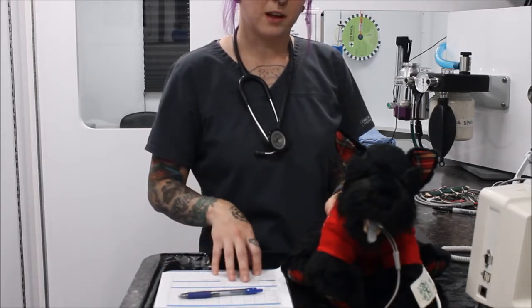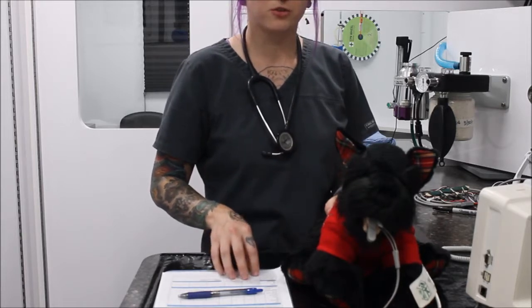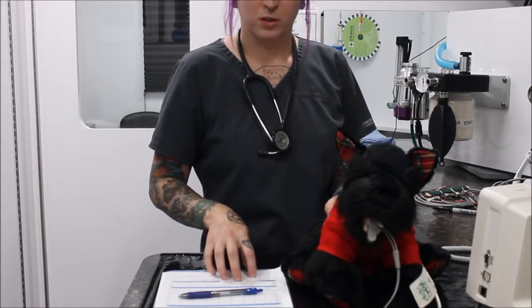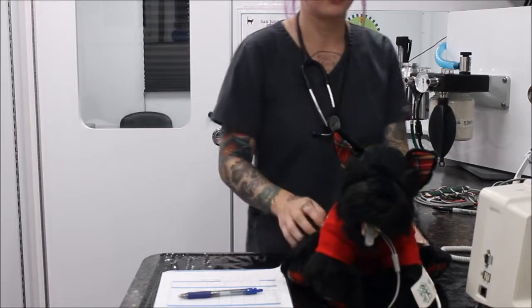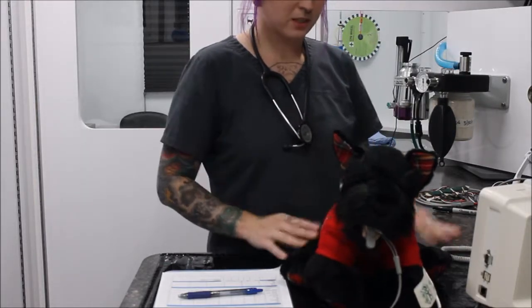And then you've got your last stage, stage 4 of anesthesia. Usually that's the apnea stage. You're looking at cardiovascular collapse at that point as well. So you really want to monitor your depths of anesthesia and your stages, just to make sure your patient is always good and not too deep. So let's move on to our reflexes.